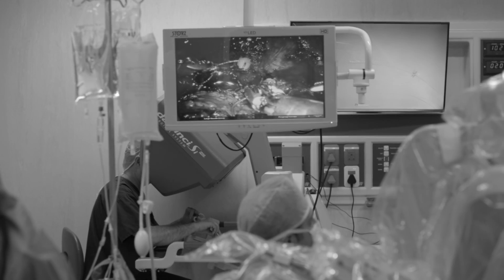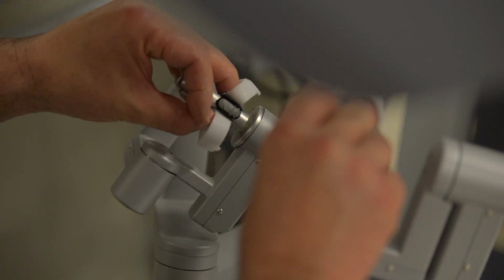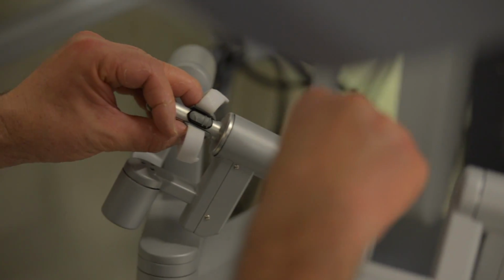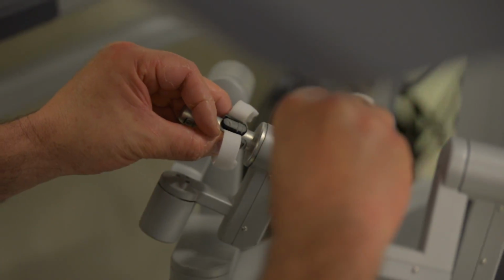Each exercise you need to complete with an average of above 90% for that exercise. Points are deducted, for example, if your instruments move out of view, or if you have too much movement on the inside, meaning you move around without doing the proper exercise as they want. Time-wise, I usually want you to do 20 hours plus. Me and my colleague did, I think, 3 times that to train ourselves and make sure we are well trained.